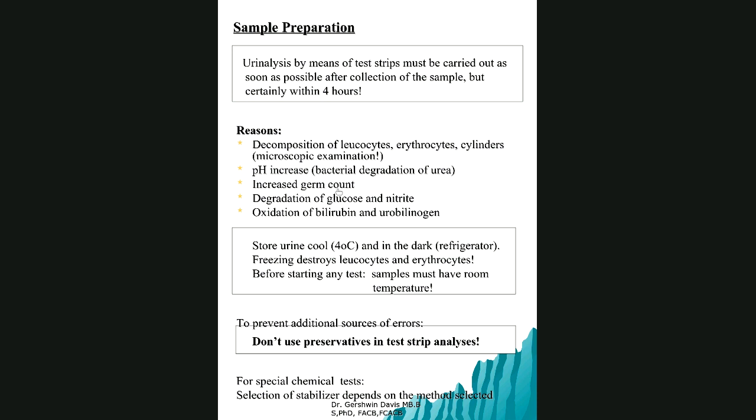So the patient really does not have a UTI, but because the urine has been sitting there, with bacteria and glucose at room temperature, you can get multiplication. So that's why you should actually do it. Don't delay. So that's the germ count, and of course the rest: decomposition, oxidation, etc. I hope everybody appreciates that. Basically, it was very important. This is something you do almost every day.